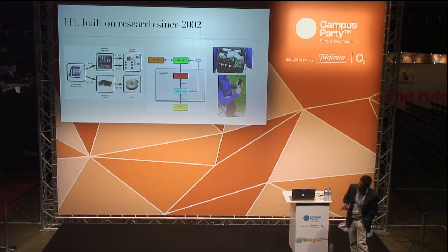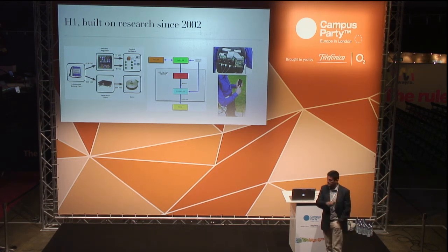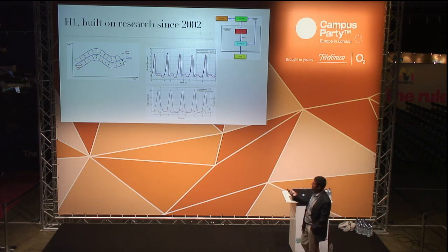So basically, we have a MATLAB and a Simulink system, so we are able to set up all our control strategies in these two environments, and then we download these control strategies to the real-time controller that is implemented in the system, and then it can work for hours. So this is just an example of how the system can be operated.